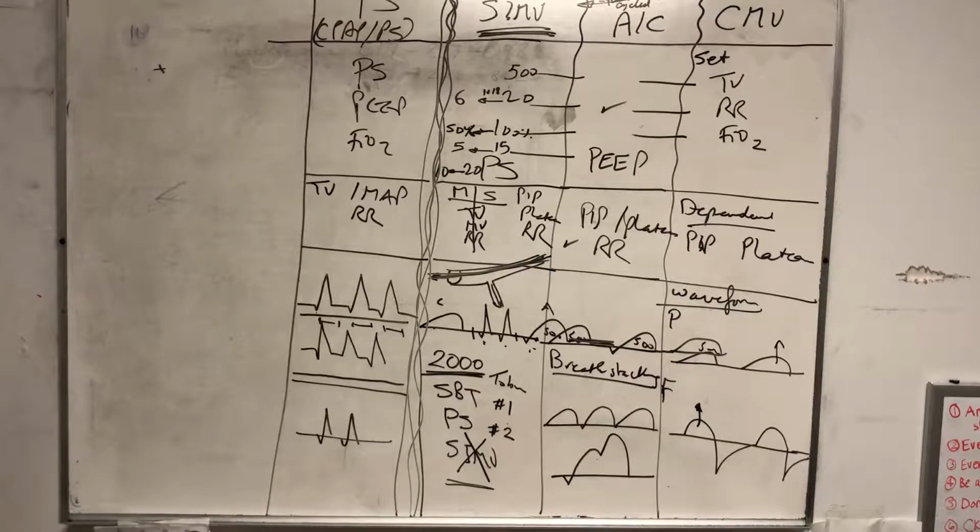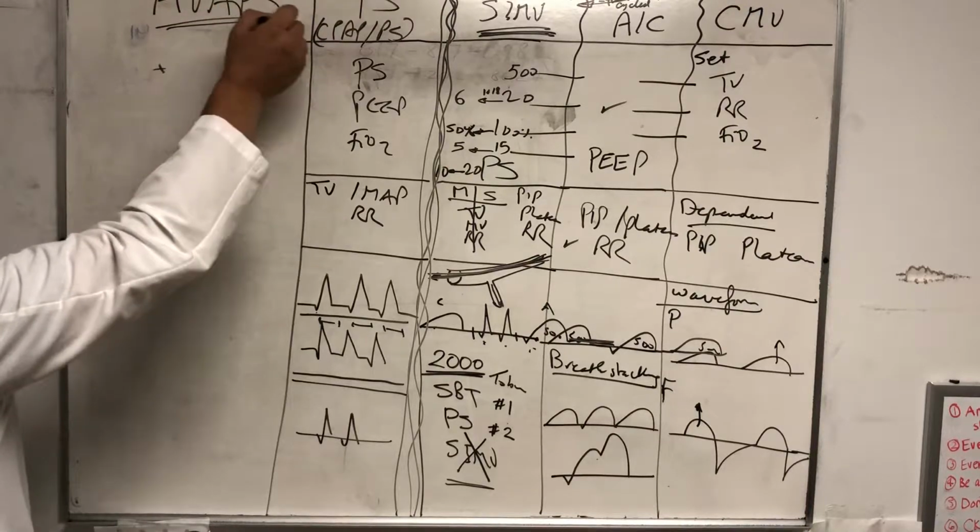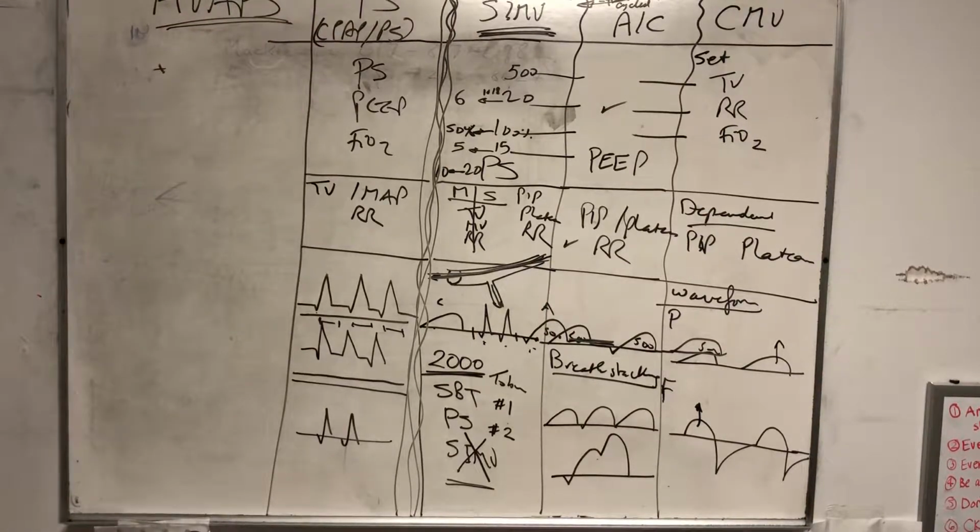This mode of ventilation is gonna come back, and probably is coming back as we speak, as a strong mode of ventilation that may actually take over, or at least partially take over, the volume control that everybody likes. It's gonna come back in a mode of ventilation called AVAPS. AVAPS is one of the advanced modes of ventilation. So when we talk about three obsolete, three current, and three advanced, I'm just cheating. I'm going to the last lecture of the vent, which is the advanced modes of ventilation. But it's the same thing as pressure support, and that's how pressure support is probably gonna come back.